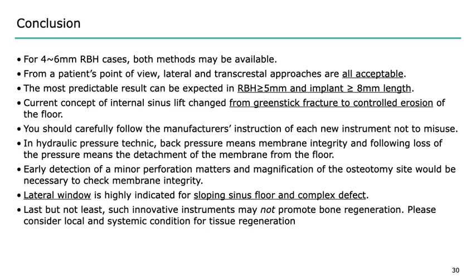In hydraulic pressure technique, back pressure, some kind of a regurgitation, means membrane integrity, and following loss of the pressure means the detachment of the membrane from the floor. Early detection of a minor perforation matters. So in that case, you would need some kind of a magnification. So magnification of the osteotomy site would be necessary to check the membrane integrity. Without any magnification, you may not be able to find your tiny small perforation at the floor.